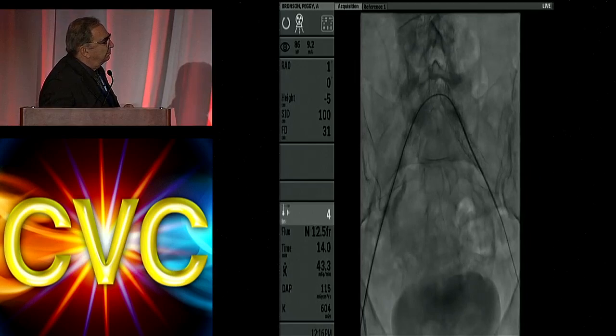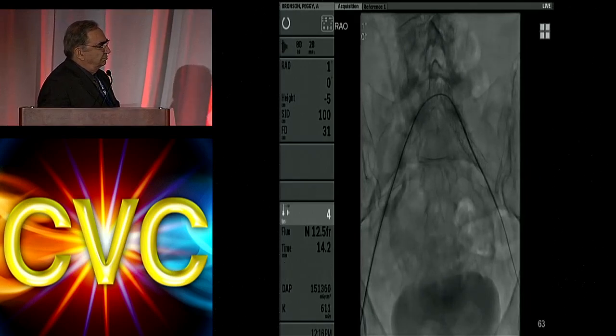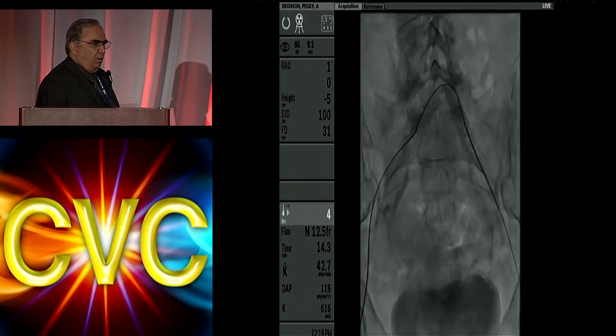Could you stick on the other side and just come up with a small wire system, and using this catheter as a guide, see if you could, I don't know if there would be enough room in that slot to slide something else through there, and then try to dilate that with the balloon introduced from the other side?